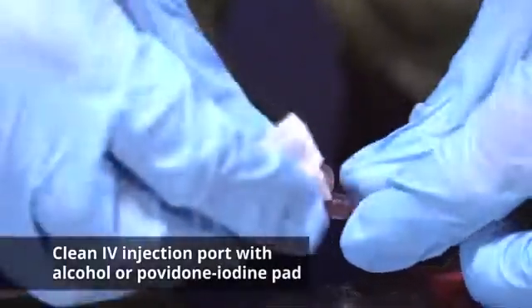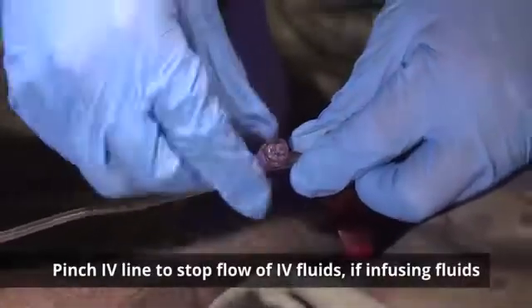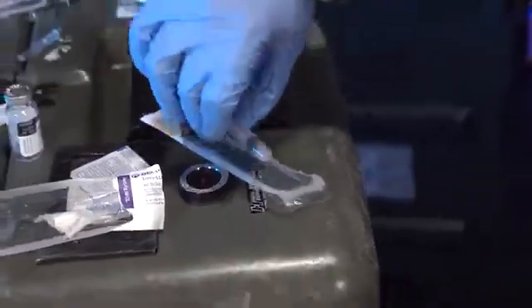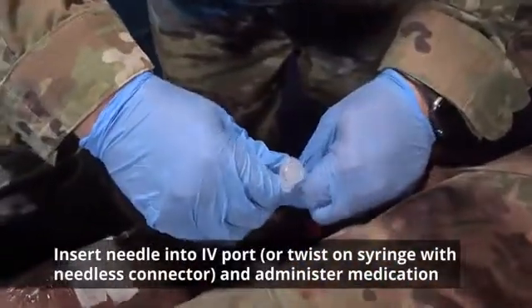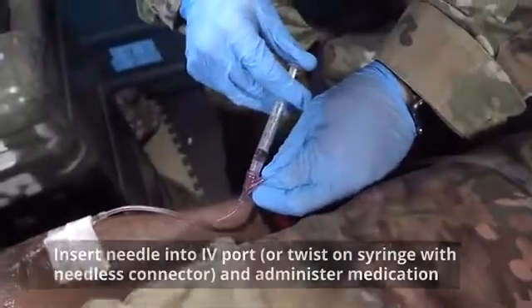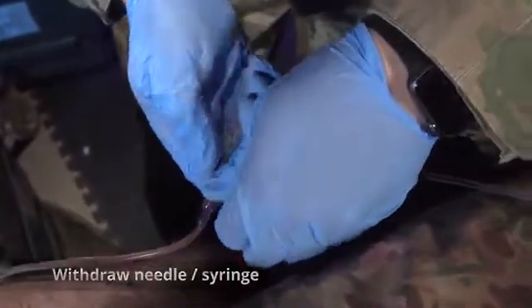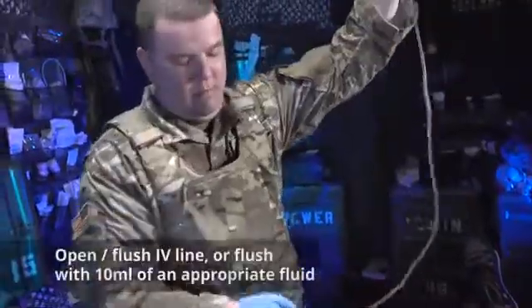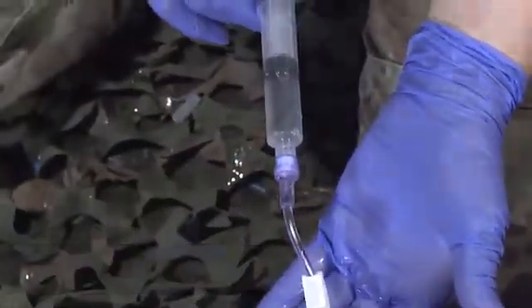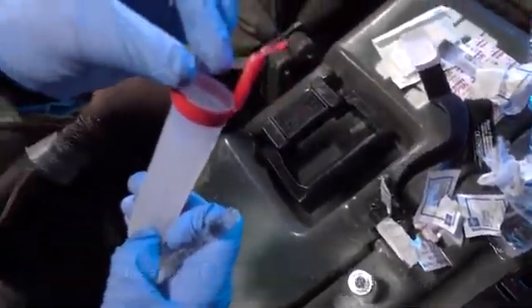Now clean the IV injection port with an alcohol or povidone iodine pad. Pinch the IV line to stop the flow of IV fluid if fluids are being infused. Insert the needle into the IV port and administer the medication. Withdraw the needle. Open the IV line to flush the line or flush with 10 ml of an appropriate fluid. Dispose of the expended needle and syringe appropriately in a sharps container.